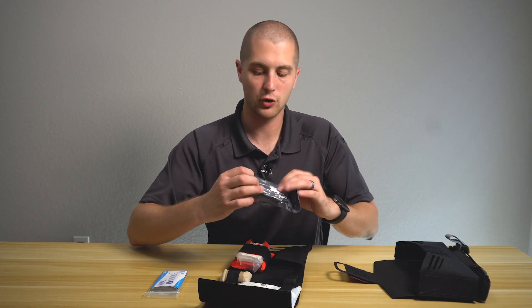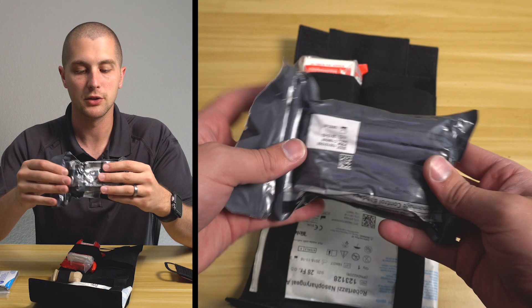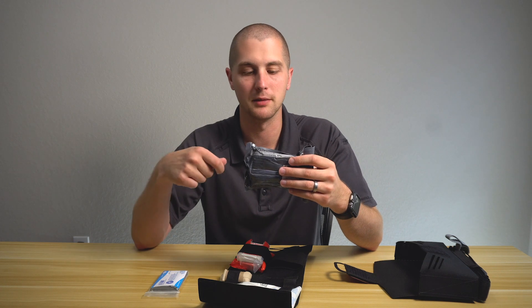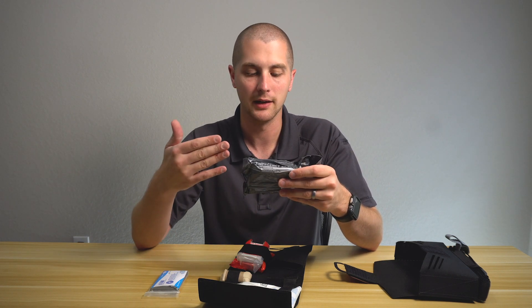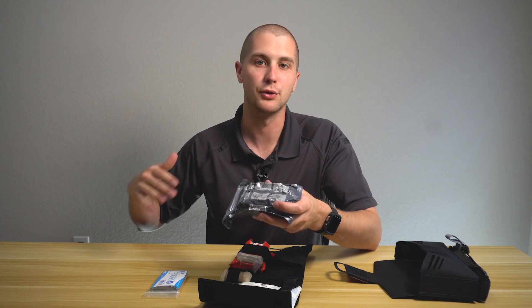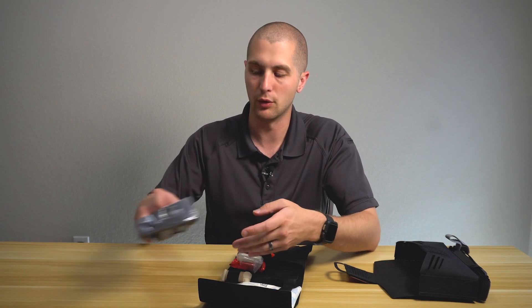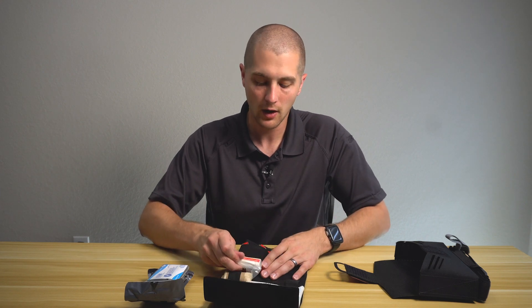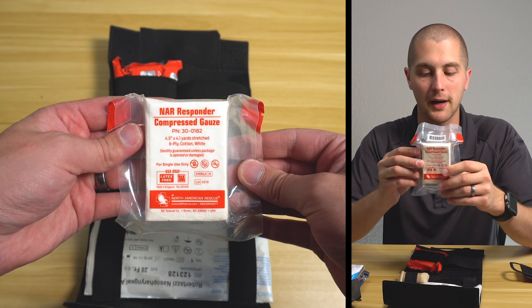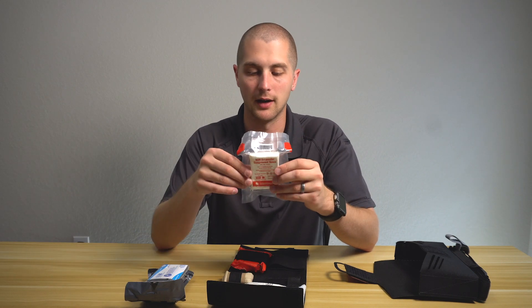Next to that, we have a trauma bandage — a pressure bandage that's very tightly rolled, which is a necessity in any major bleeding kit. This will allow you to keep packed gauze in place or stem major bleeding. This particular bandage has a hook that you can feed it through and pull back on itself to create more pressure on the wound — a good thing to have. On the other side of that same compartment, you have North American Rescue compressed gauze for wound packing, which can also be used as a wrap or a secondary pressure bandage.